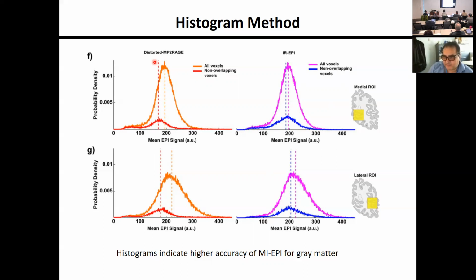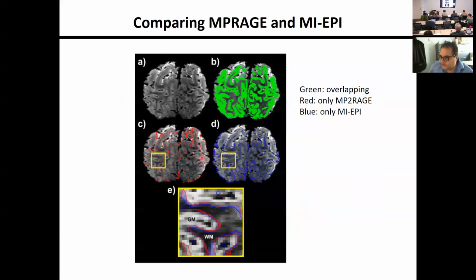I guess it is worth it also to actually present the non-matching voxels on the image and see that they overlap with veins in this case. You can. Yeah, I mean, that's a little bit implicitly here. These are the non-overlapping voxels from MP2RAGE. And you see a lot of these are at the border to CSF and so on. Here, for example, CSF.